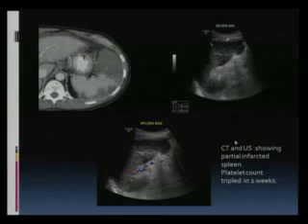Okay? This is the same patient at follow-up. So you see, this is the spleen which is alive. This is the portion that we've embolized. This is how it looks on ultrasound, the embolized spleen. Okay? And this is the flow to the spleen. So showing that only a partial spleen was embolized, the platelet count tripled in 2 weeks, and they go back to the chemo.